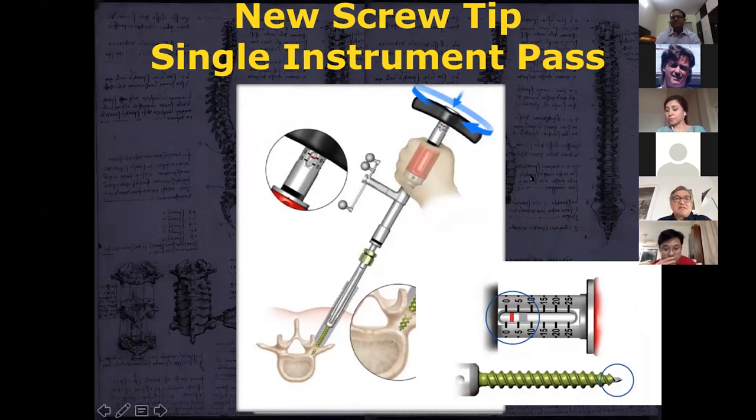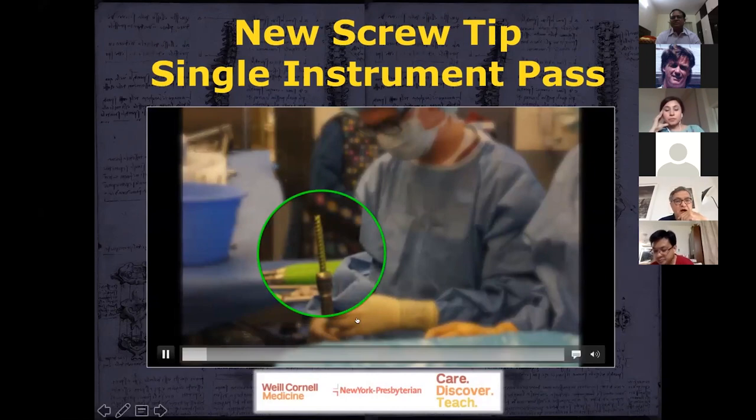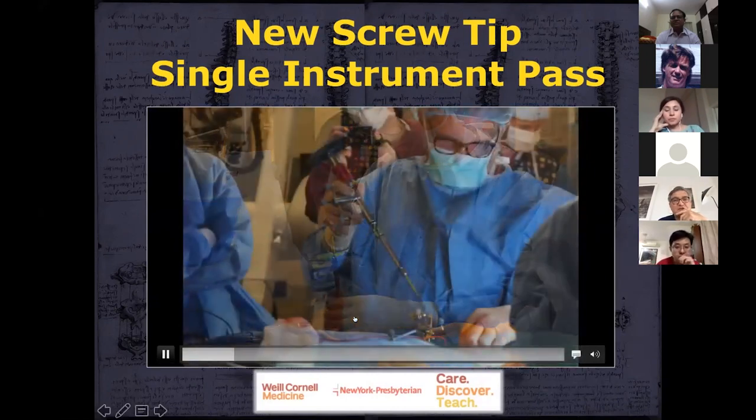Now, several companies now have these types of pedicle screws available. These are single pass pedicle screws. As you can see here, they incorporate a K-wire into the tip. They have a very aggressive screw tip. We navigate this pedicle screw, and that allows us to really cut down on the number of instruments that we have to navigate. So there's no Jamshidi needle, there's no awl, there's no tap. Everything is incorporated into this pedicle screw. Makes it very easy and makes it very cost effective and time effective to insert this pedicle screw under navigation. So that's the pedicle screw.